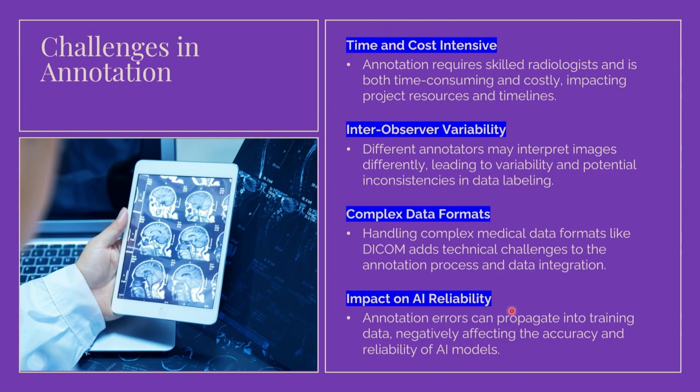So now what I want to present is that the annotation process is very challenging, right? Different observers may have different performance, and the task actually involves a lot of manual work and is time consuming. This is the key message that I want to bring about for today's talk.